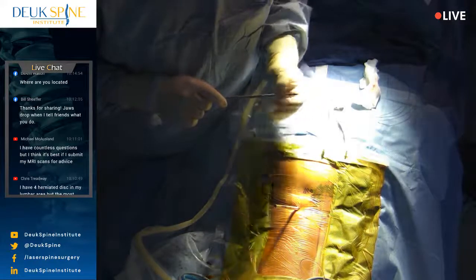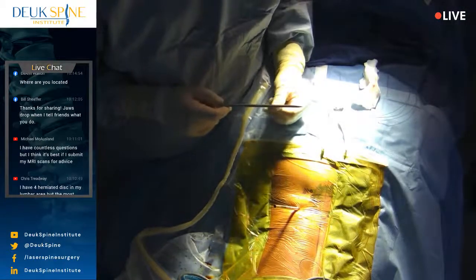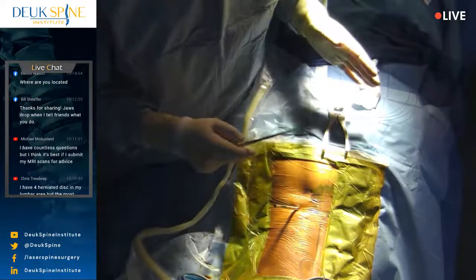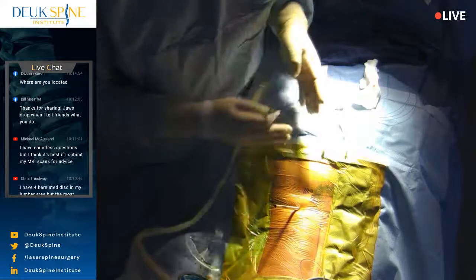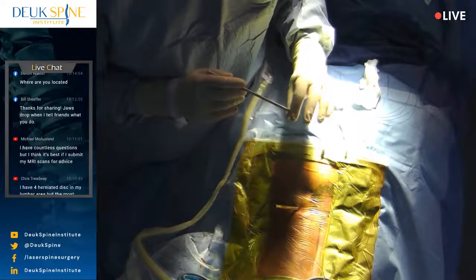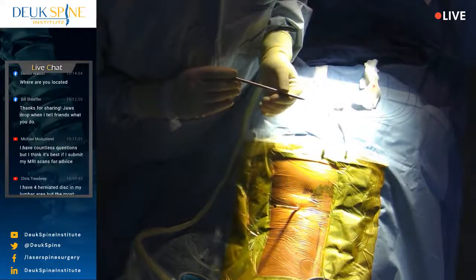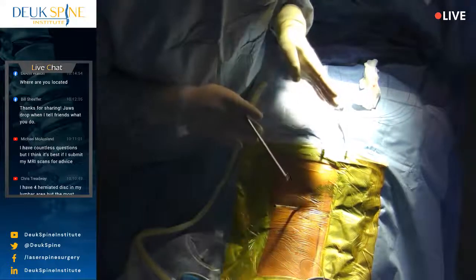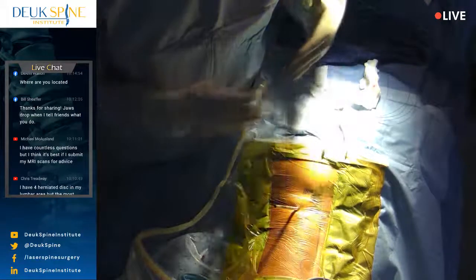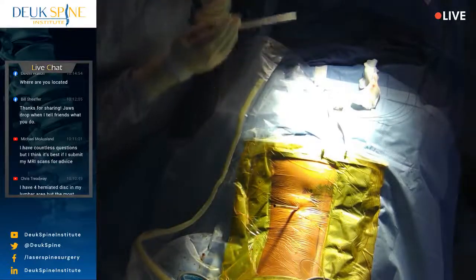It's almost like an aerodynamic, but I guess you can call it a tissue dynamic instrument. Like aerodynamic things split the air going over them and cause airflow to go above or below or to the sides. This thing is a tissue dynamic instrument. It literally splits the muscles and doesn't cut them. It literally just separates the fibers. And you go through, and then when you come out, you're done. And the muscle's not torn, it's actually just spread. And it comes back to its normal shape.